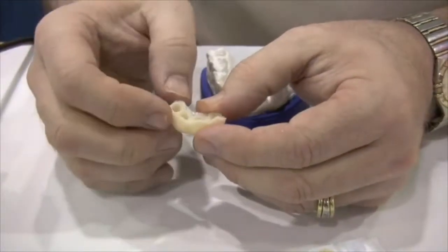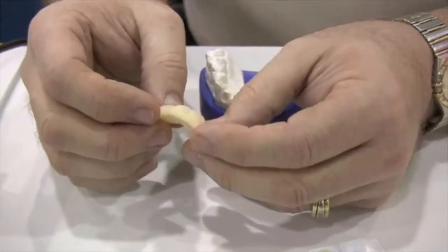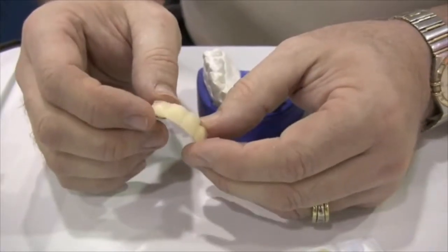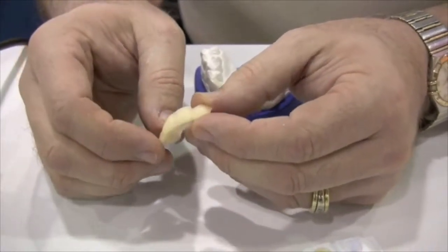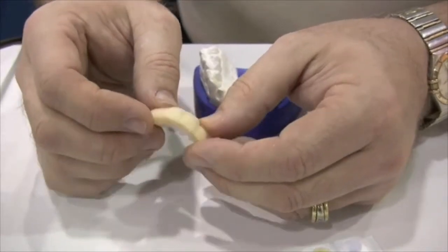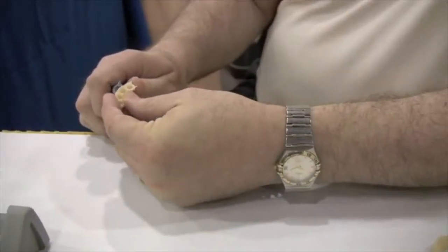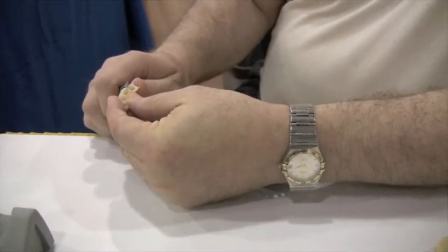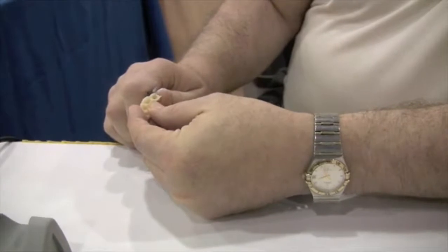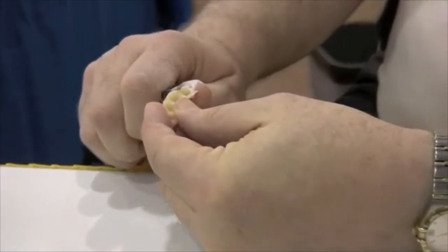Our next step is going to be to remove some of the excess around the margins and do a little bit of carving. We've got pretty decent detail from our preoperative model, so there should not be too much carving to do. I'm going to start and just remove excess around the margins.